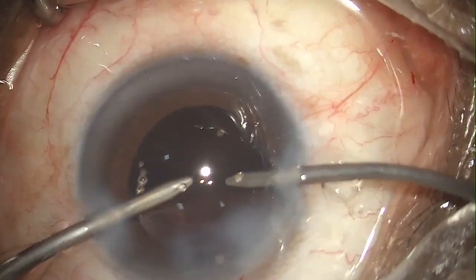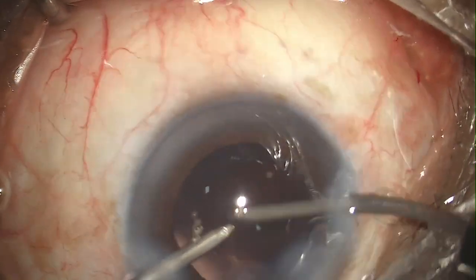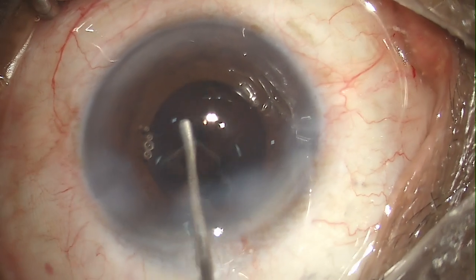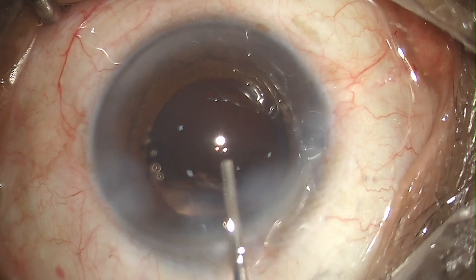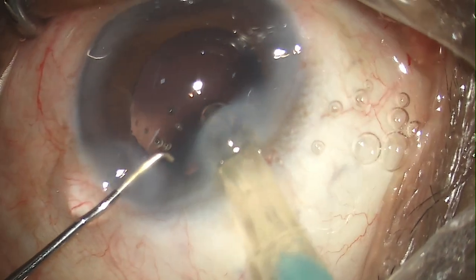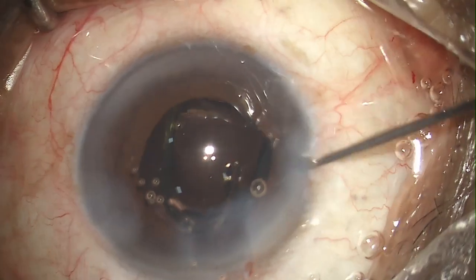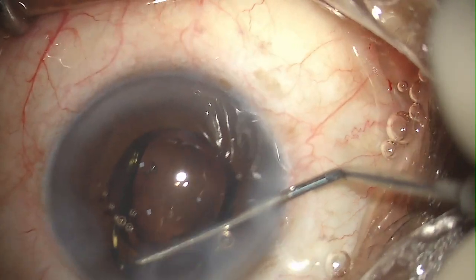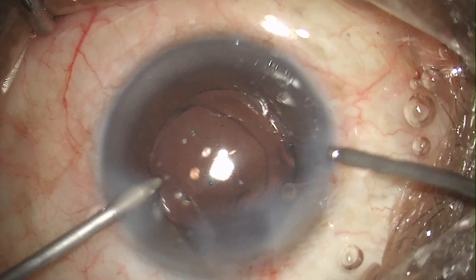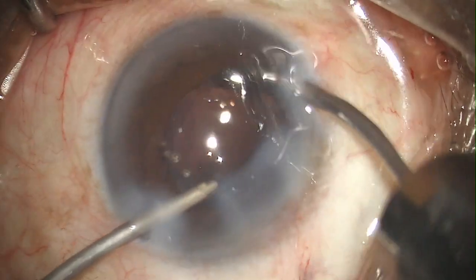Next is our intraocular lens implantation. I'm polishing here and there a little bit. As you can see the red reflex is not that great here and I'm not able to see the posterior capsule well. I'm forming the bag and going with the intraocular lens. The injection of the lens was not that smooth — this is not a great way of injecting the intraocular lens, as it could lead to posterior capsule rupture or even zonular dialysis — but I was lucky in this case and nothing like that happened.